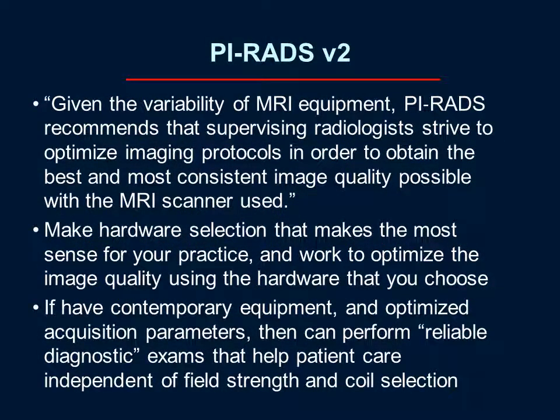In terms of what to take away from this, elsewhere the document states, given the variability of MRI equipment, PI-RADS recommends that supervising radiologists strive to optimize imaging protocols in order to obtain the best and most consistent image quality possible with the MRI scanner used. And this is a really important point. We have to make the hardware selection that makes the most sense for our practice, and then work to optimize the image quality using the hardware that one chooses.